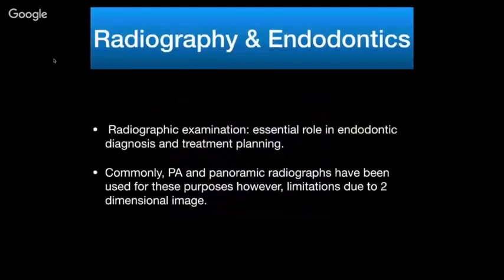So, it is well known and recognized that radiography and endodontics go hand in hand, and radiography has substantially developed endodontics in the diagnosis for examination as an essential tool. Commonly in dental practice, the X-ray is a combination most of the time between the periapical X-ray and the panoramic radiographs.